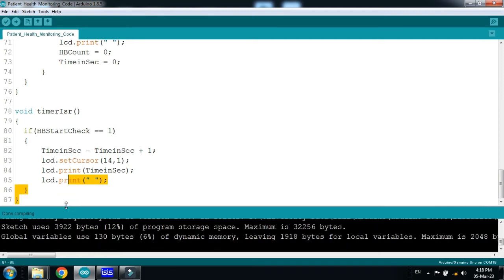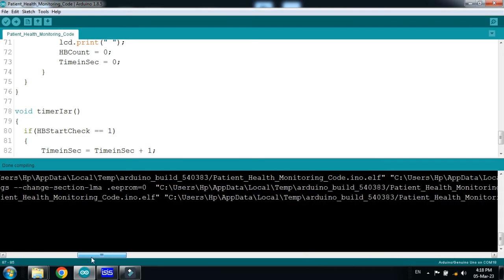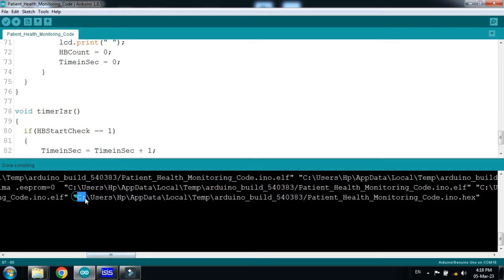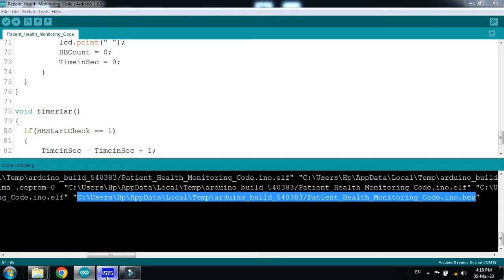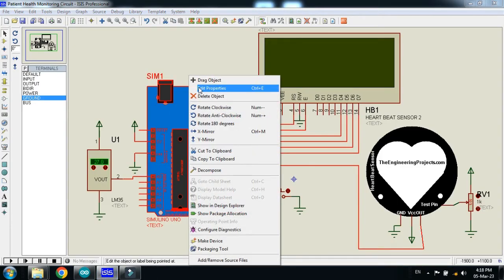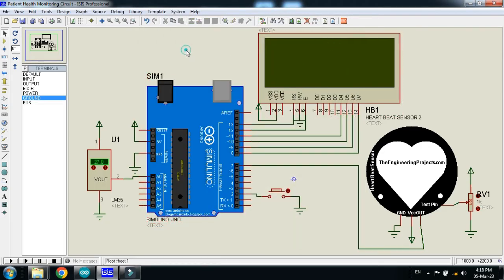Now copy the hex file address — select it from here to there and press Ctrl+C. Now paste it in the Arduino properties field and click OK.